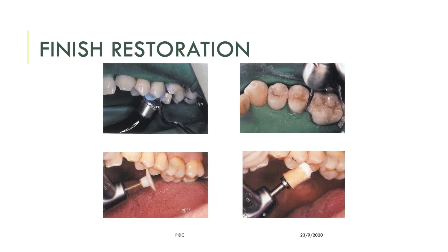Once it is seated properly, make sure the excess cement is removed with the help of floss from the interdental surface, and you can make sure the occlusal surface is also cleared. The excess material from the occlusal surface is also removed with the help of a small gauze piece or small sponges. Once it is done, you can light cure the resin cement for 40 seconds.